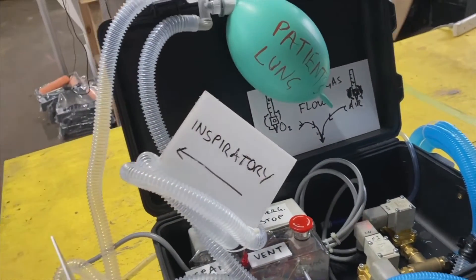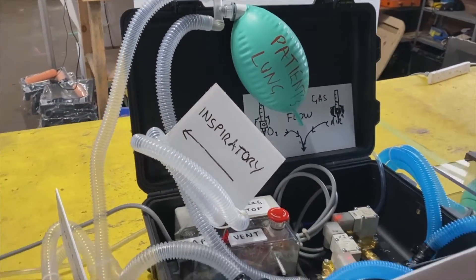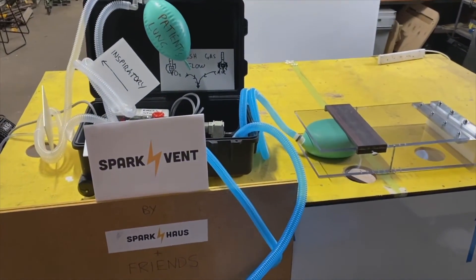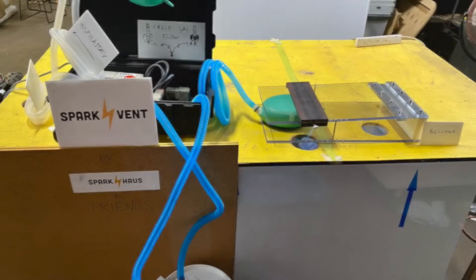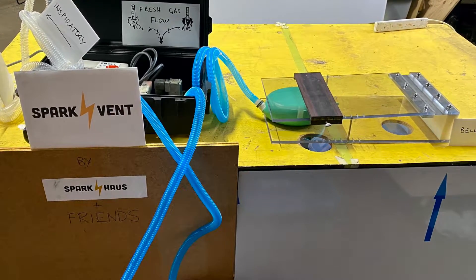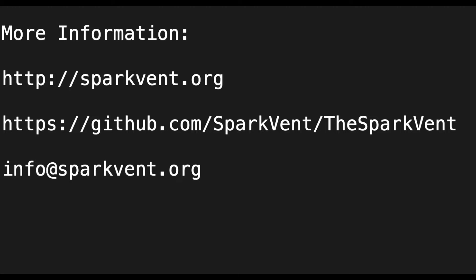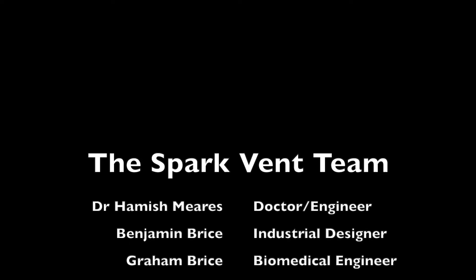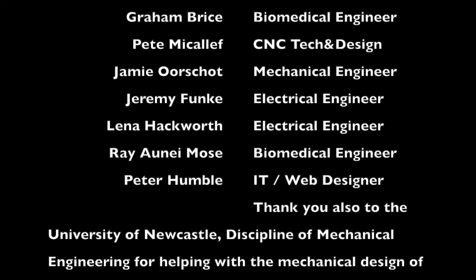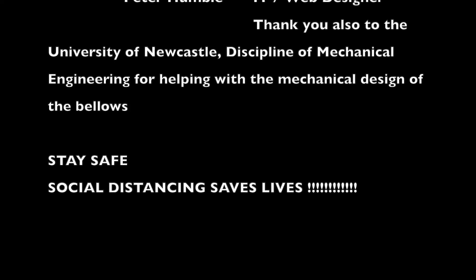And essentially that's pretty much it. Things we would like to add would be some means of measuring tidal volume, but I believe the system could be used with just an end-tidal CO2 and saturation monitor. This is the Spark Vent — we'll keep on improving it as best we can. If you want more information, check out the websites or shoot us an email at info@sparkvent.org. Last, and definitely not least, I'd like to give a big thanks to the Spark Vent team, who are a mixture of engineers, doctors, and people going above and beyond to try and help. Stay safe — thanks a lot.